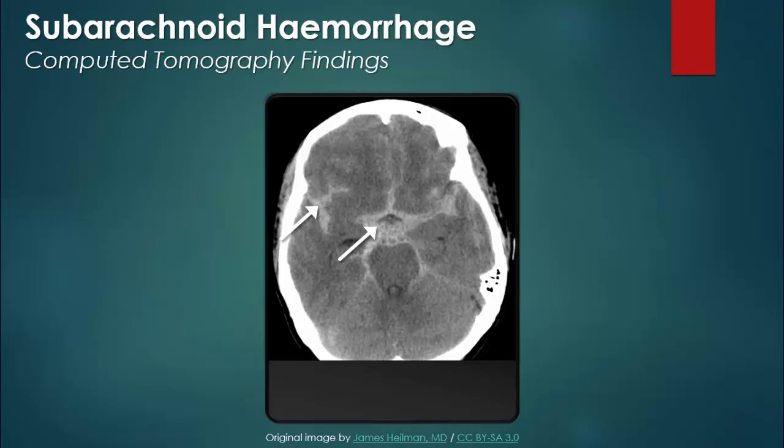This non-contrast CT was taken from a patient with a subarachnoid hemorrhage. The white arrows are pointing to areas in the subarachnoid space, or more specifically, the basilar cisterns and the sulci. In this patient, those areas are hyperdense, meaning that they are a lighter shade of gray than what is normal. In the appropriate clinical context, high attenuation in these locations indicates the presence of blood and thus a subarachnoid hemorrhage.